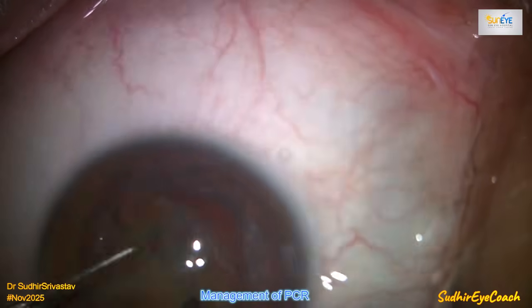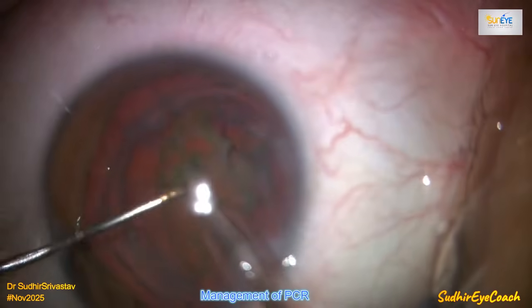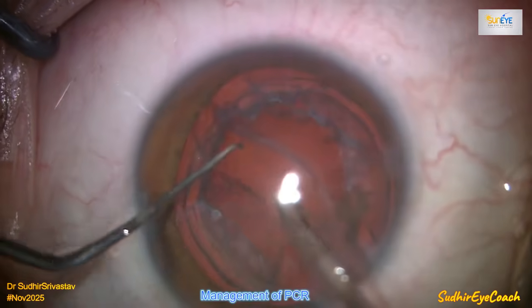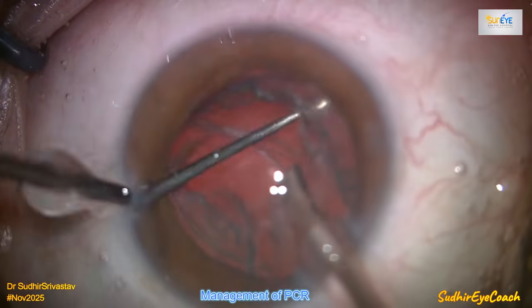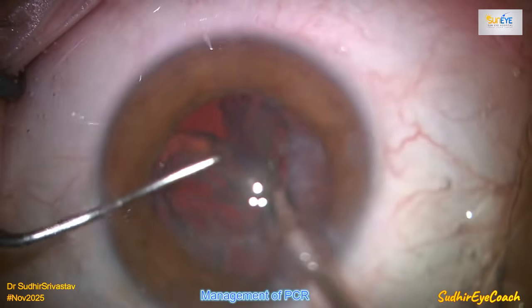Normally I do the hold and split technique, where I hold the nucleus with the phaco tip, and with the second instrument as a fulcrum I split the nucleus into pieces. You can call it a kind of vertical chop technique.